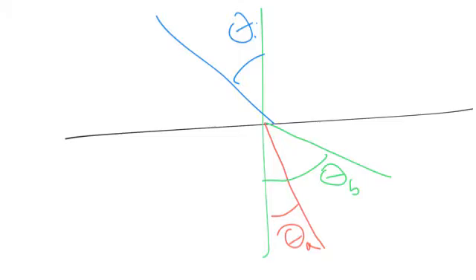Okay. Hmm? Sasha has a question. Go ahead. Is this where a crossbeam helps? Yeah, this is where crossbeam will definitely help you, but we haven't got there yet. She's asking about compound imaging. Yes, that's where you would turn on your crossbeam to help see that area. But there are some problems with that too, and we'll get to them.